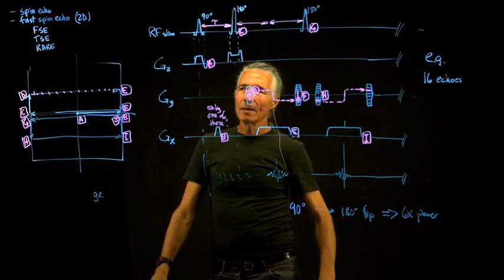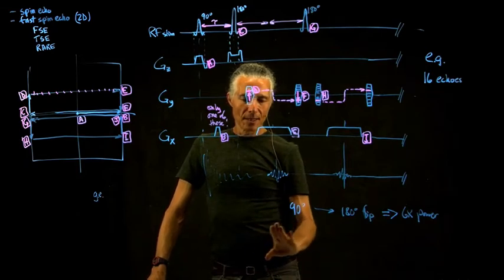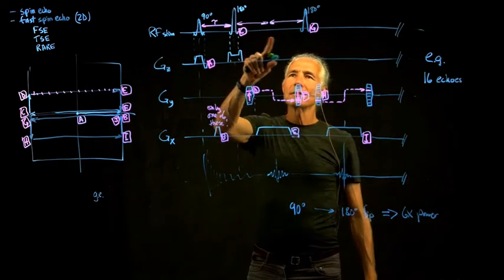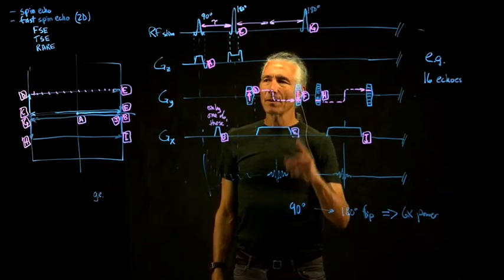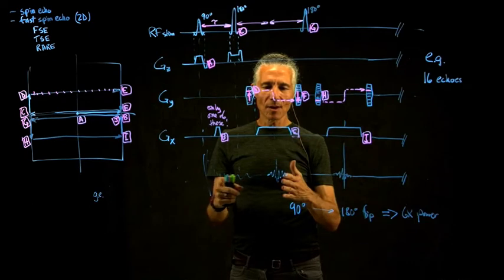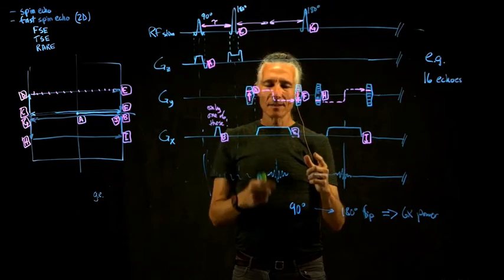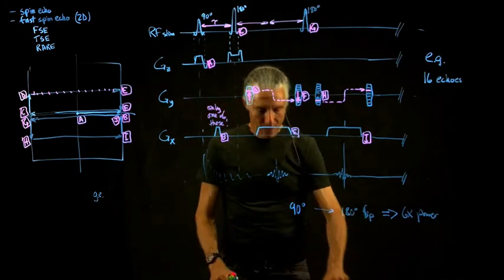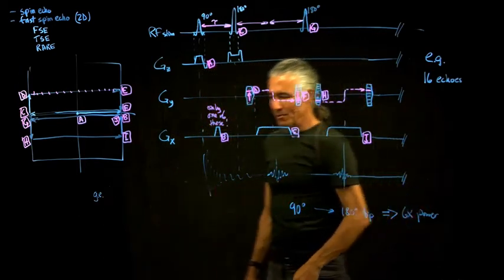So you have to model that as well, but what you can do then is very carefully monitor how much RF power you deposit into the subject. One of the problems is since a 180 is so much more power than a 90, you can't do that many of them, and that's one of the things that constrains how many echoes you can do. You might be able to do this more like echoplanar, with a really rapid set of echo trains, and then collect the data in much less time. So that's one of the problems that stops you at, say, something like 16 echoes.